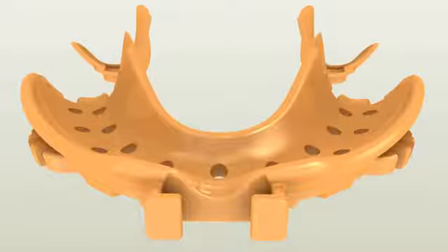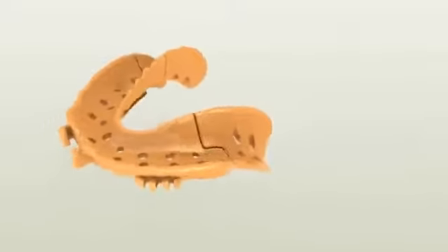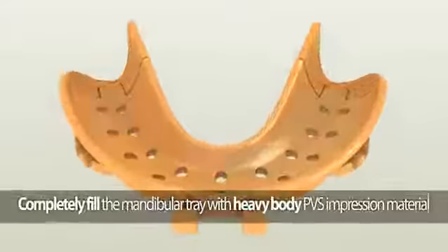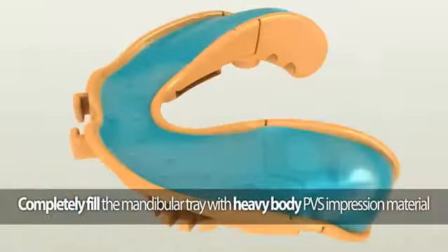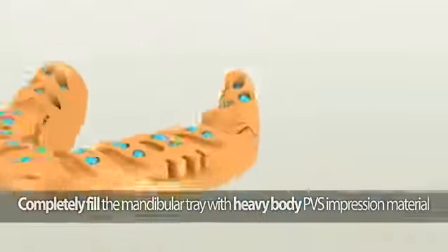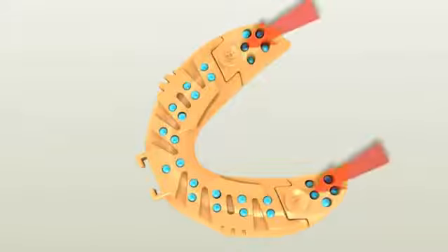Making the mandibular impression: the mandibular DENTCA tray consists of three pieces. Make sure the posterior pieces are securely attached to the anterior piece. Completely fill the mandibular DENTCA tray utilizing fast-setting heavy or medium body PVS impression material. Carefully insert the tray into the patient's mouth.